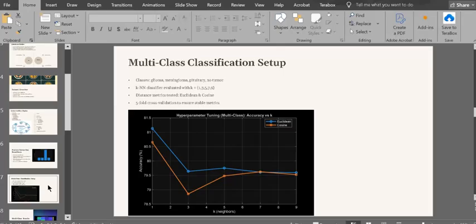We use 4 major types of features. The intensity features capture the overall brightness distribution. The texture features come from a manually constructed GLCM-like matrix with an N-level quantized image. The histogram features give a compact description of the intensity distribution, and shape features are derived from the segmented tumor mask, using the mask perimeter, area, eccentricity and circularity. These handcrafted features give us interpretable signals for the classification.